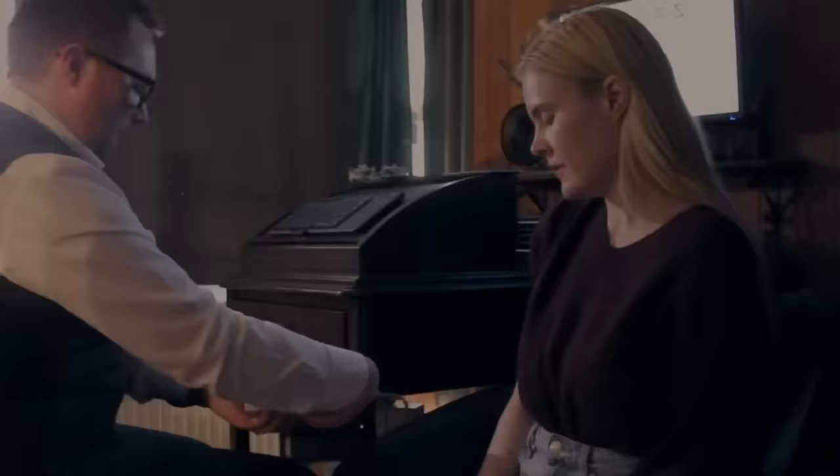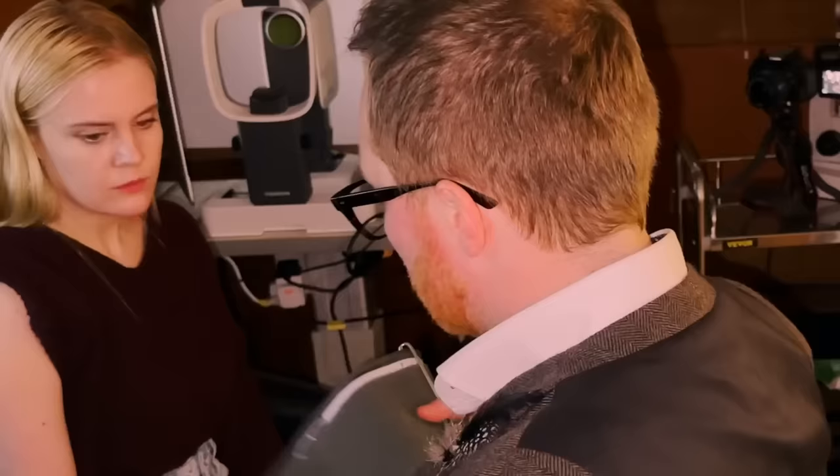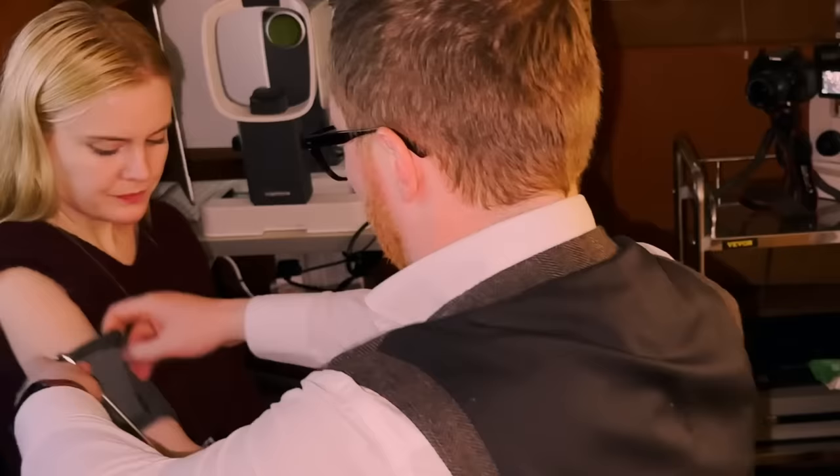So, have you had your blood pressure checked recently? I don't think so, no. So, as I say, it's important, because obviously we've been having a look at the blood vessels at the back of the eye, it's important to have a look at the blood pressure, because that will put into context how the blood vessels themselves are appearing. So we'll pop this onto your arm.